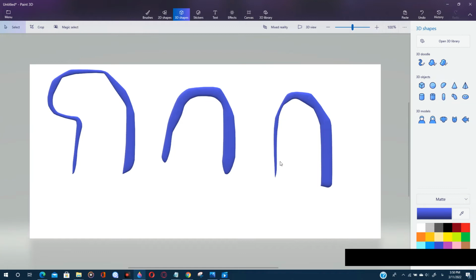We say hypokinesia, and in this item we see aneurysm or dyskinesia due to severe MI, myocardial infarction, and this greatly reduces the contraction of the LV, cardiac output and EF.